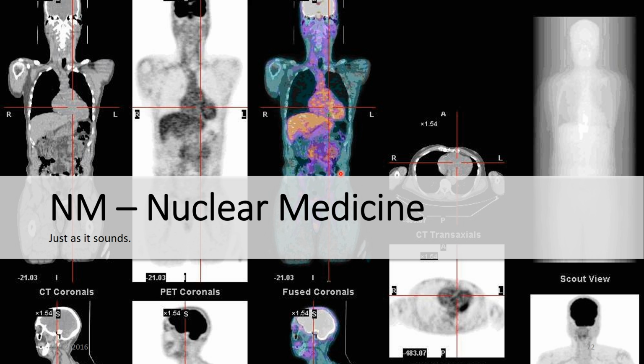So, nuclear medicine. Nuclear medicine is just as it sounds. We use something called technetium. You don't need to worry exactly what technetium is, but it is a metastable isotope, technetium-99m, M meaning metastable. What we do is we tag that or bind it to something that attaches to a specific organ in your body, or a particular organ system, for example. So we can do cardiac scans, myoviews. I don't know whether that's an actual copyrighted brand of the material, but nuclear medicine is good for one major difference from normal radiography or medical imaging.